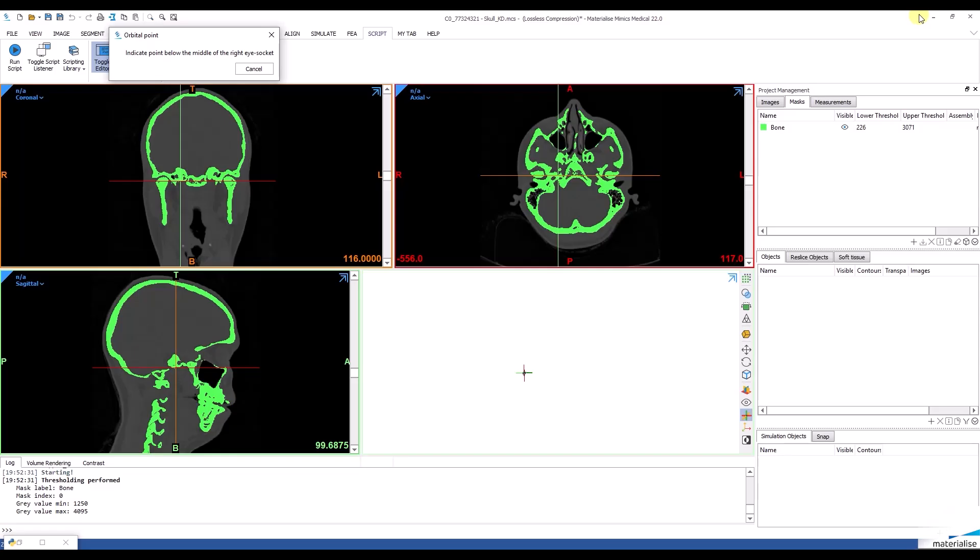Additionally, I indicate a point in the middle of the right eye socket and a point under the maxillary sinus hole.